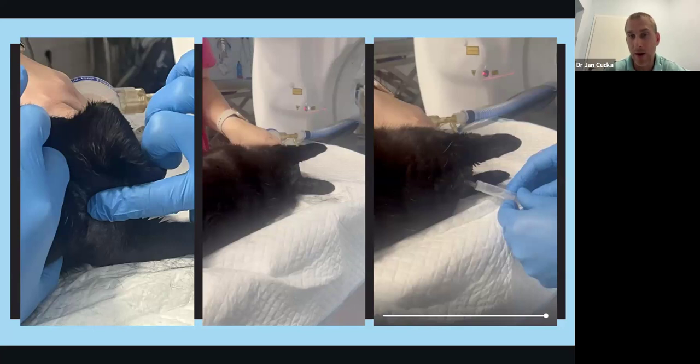So I don't know what's the biggest scare about not doing myelographies. What I usually heard from my colleagues is that what scares them are seizures, or improper application, or some kind of damage to the spine.